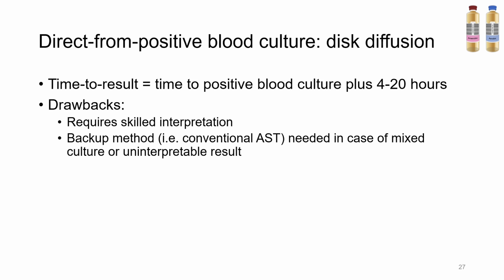But this test, while looking quite simple on the surface, requires that whole complex lab structure in the background. You need super skilled technologists, and you need proper reagents and quality control throughout. So it can be used certainly in a high resource setting, but it's a bit more challenging to use in some limited resource settings. And you certainly need a backup method if it's not going to work for whatever reason.